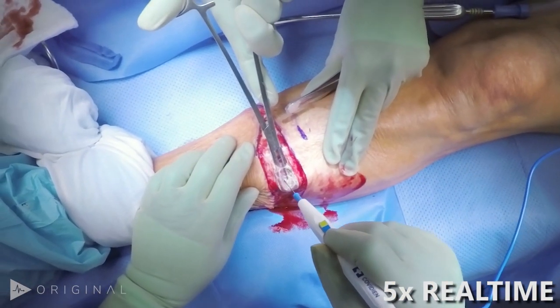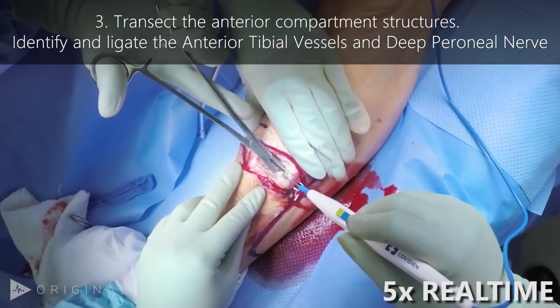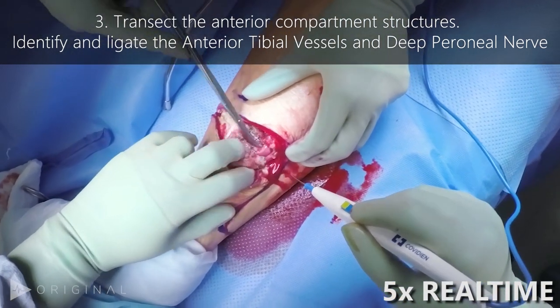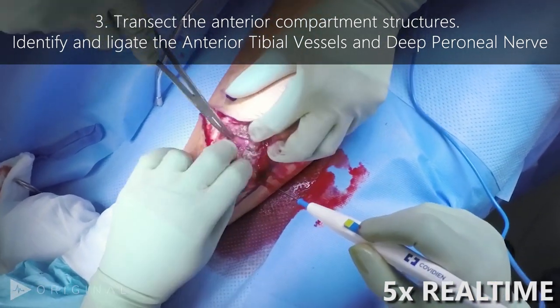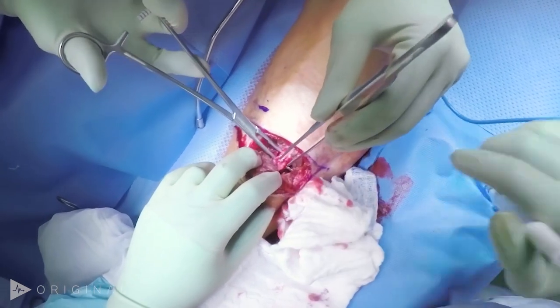The next step in the procedure is to cut through the anterior compartment muscles. This is done in line with the original incision. Bleeding here is rarely troublesome until the neurovascular bundle is encountered just anterior to the interosseous membrane. We clamp and tie the entire neurovascular bundle.